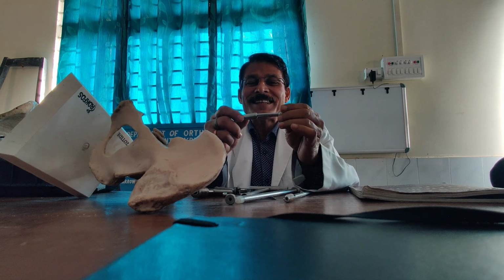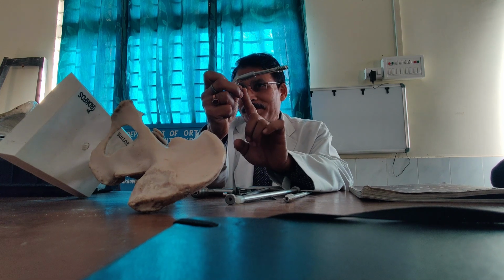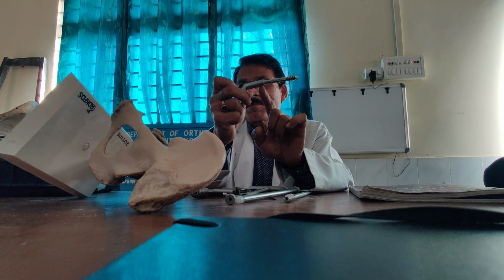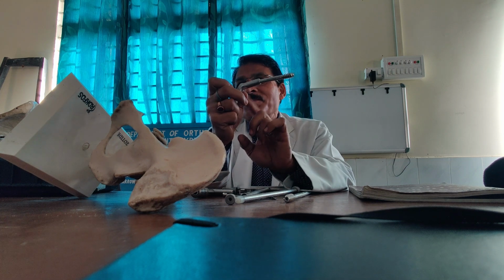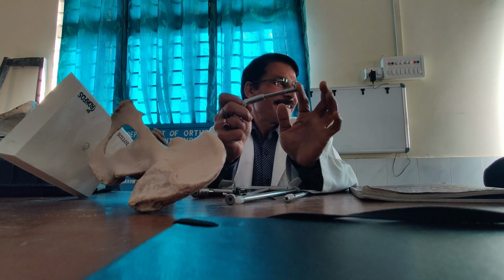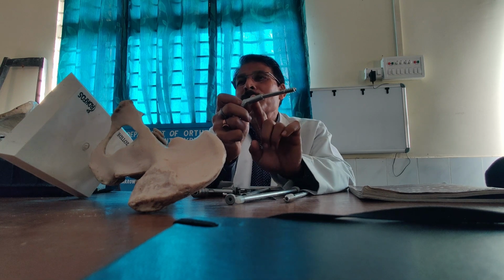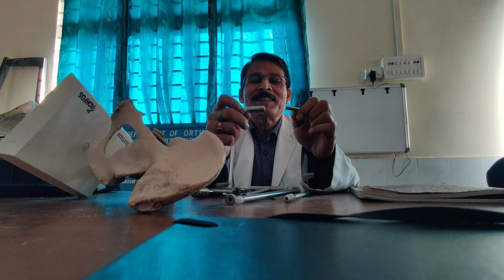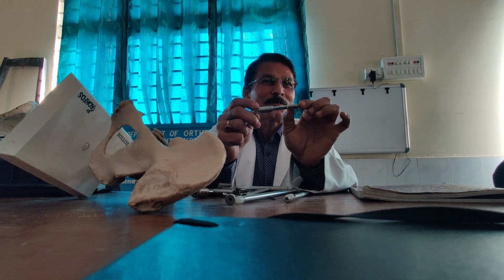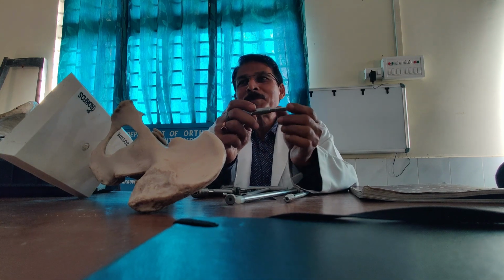See? So if it is like this, I am okay. The device is this. See, there is a little bit of angulation, but it is essentially inside the barrel. But it is not sufficient. If it is not sufficient, then it is not going to play, it is stuck. So that is why a standard minimum part should be inside the barrel. The minimum part is almost around 22, roughly.